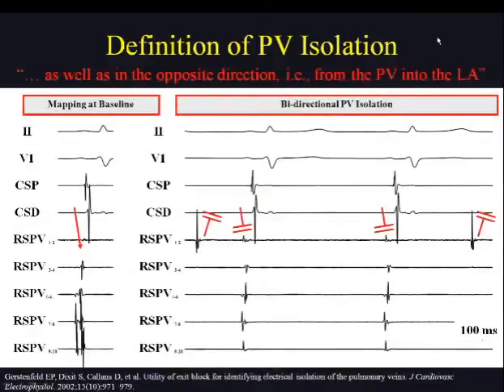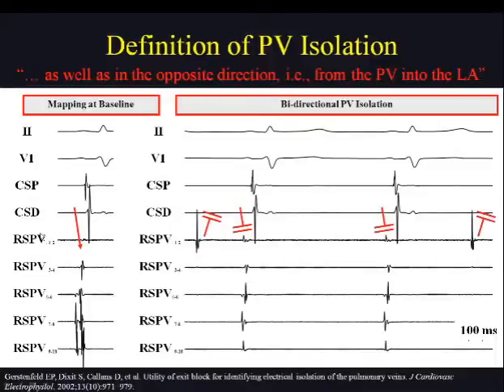The endpoint also implies block in the opposite direction — exit block. This is not easy to show because you need spacing within the circle to prove this. You will be lucky if you can have automaticity of the pulmonary vein during sinus rhythm. Here you see a PVAC tracing in the right superior pulmonary vein before ablation: a far-field potential and sharp PV potentials. After entrance block is achieved, only far field remains on the PVAC tracings, but there is a dissociated rhythm arising from the sleeves of the pulmonary veins — an example of exit block, proving bidirectional isolation.